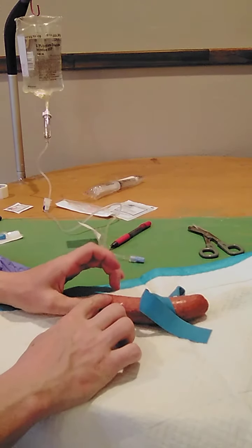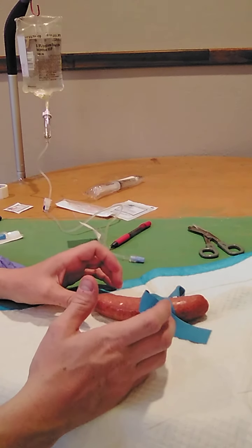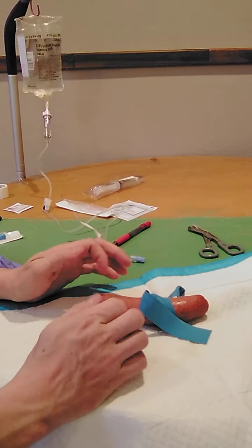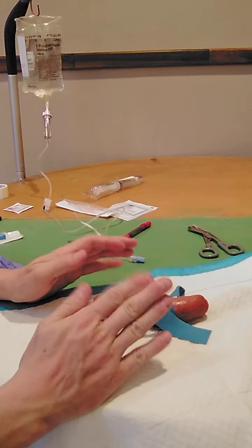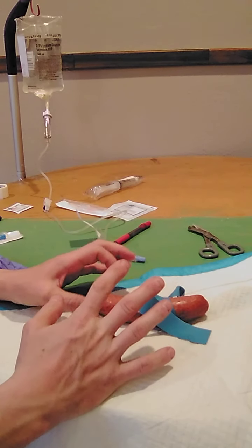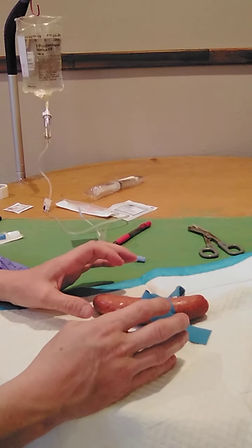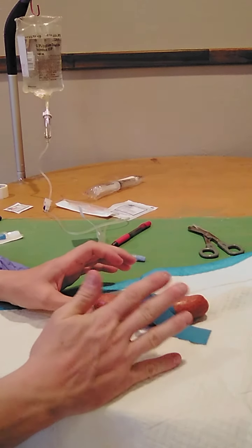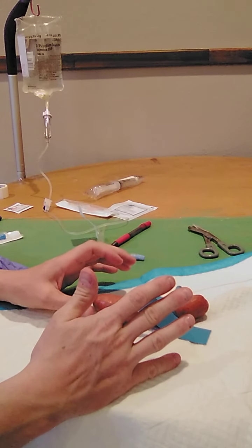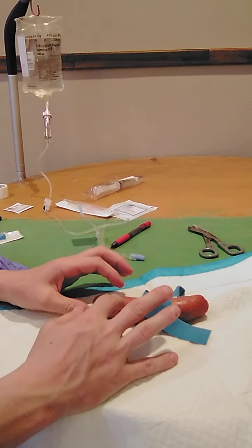So I'm going to try to palpate and observe for a good vein. So I'm going to ask the patient to open and close their arm, their extremity, and I'm going to massage from proximal to distal to try to get that vein to be observable. And if I need to, I will take a moist, warm towel. I can help that to get it to vasodilate and observe that. So I'm watching for that.